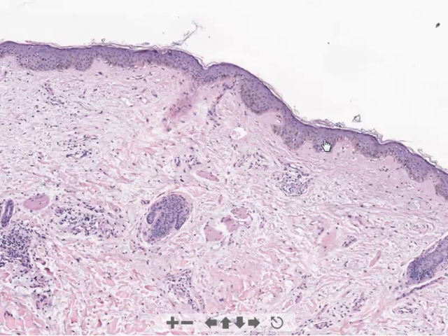How about graft versus host disease? Well, typically graft versus host disease doesn't show as much thinning of the epidermis as one would see in cases of either dermatomyositis or lupus erythematosus. In addition, you'll typically see more hyperkeratosis and parakeratosis, and at times accentuation of the granular layer. The necrotic keratinocytes that are present in graft versus host disease may be present as single cells along the basal layer, as you will see in dermatomyositis, but in graft versus host disease, these cells may also extend down adnexal structures.